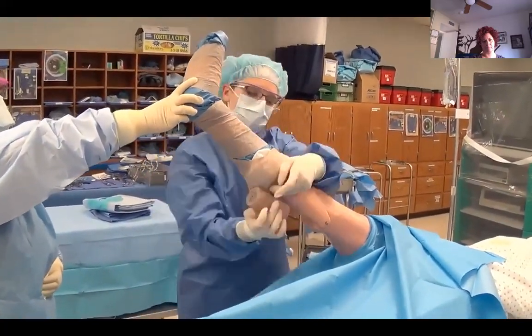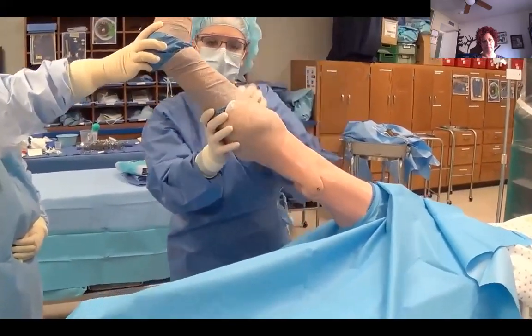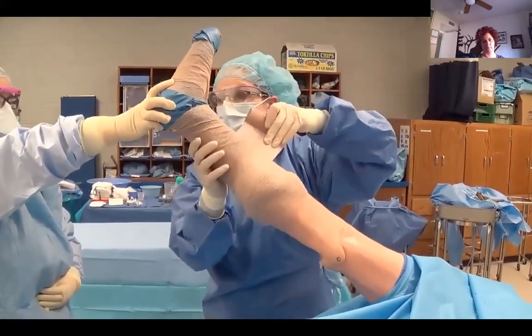So we'll assume for this case that we're doing a procedure on the knee. So I want to make sure that I leave the knee exposed and just cover the rest of that stockinette with the co-band.